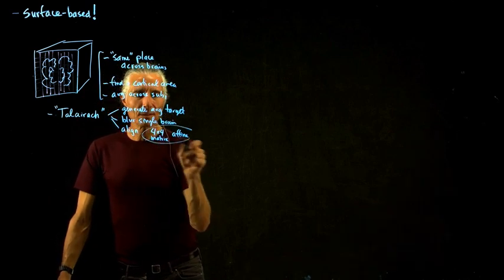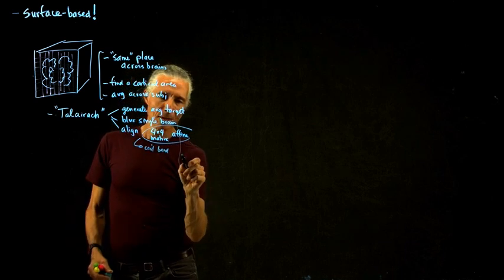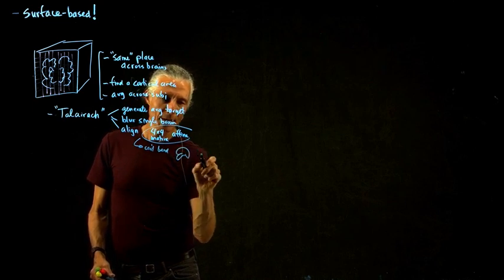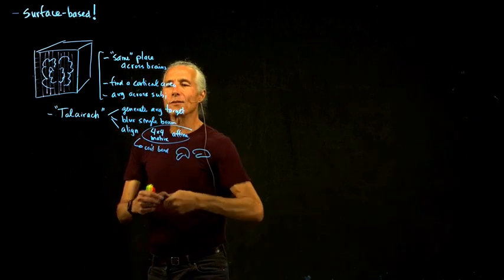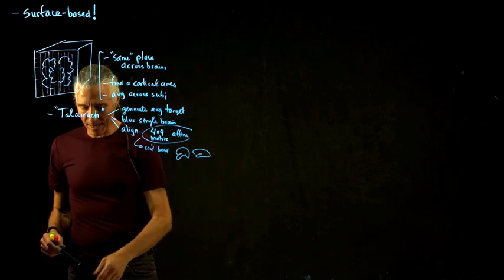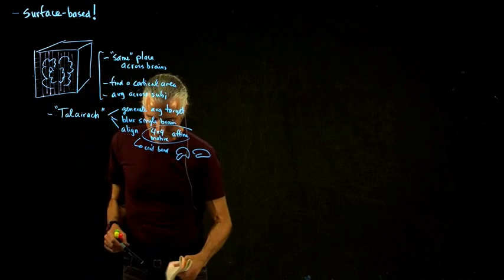So if you do this, which is very common, you can't bend. If somebody's brain looks like this, and another person's brain looks like that, it can't deal with that. It can't cause a bend in it. There are other, more complicated methods that allow bending, but you can quickly get out of hand. If you allow too much bending, things can get quite messy.